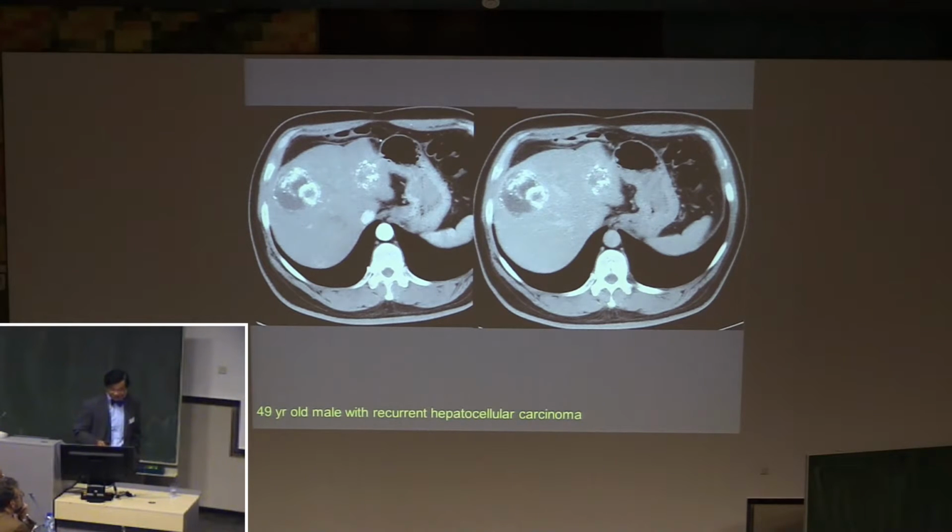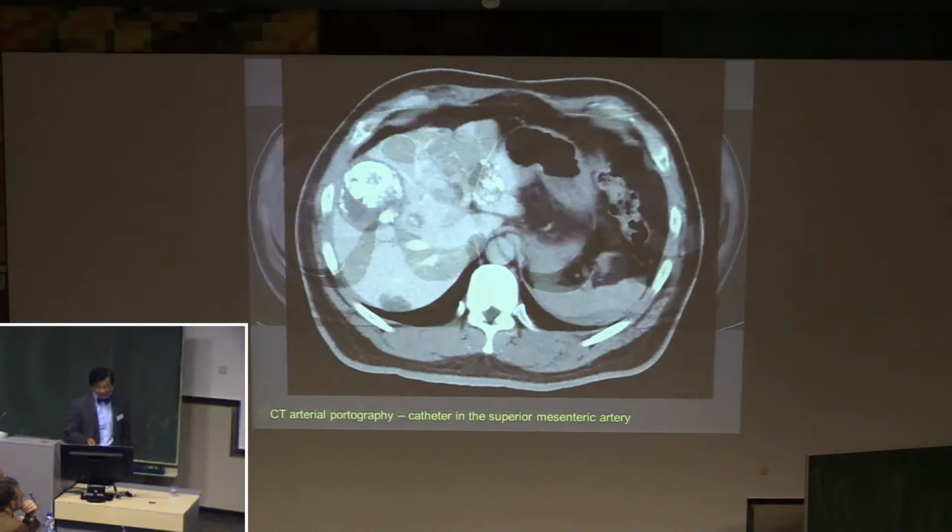Here's another patient, multifocal HCC treated before. However, it was pointed out by our diagnostic colleague that there may be a lesion there. Very difficult to tell.